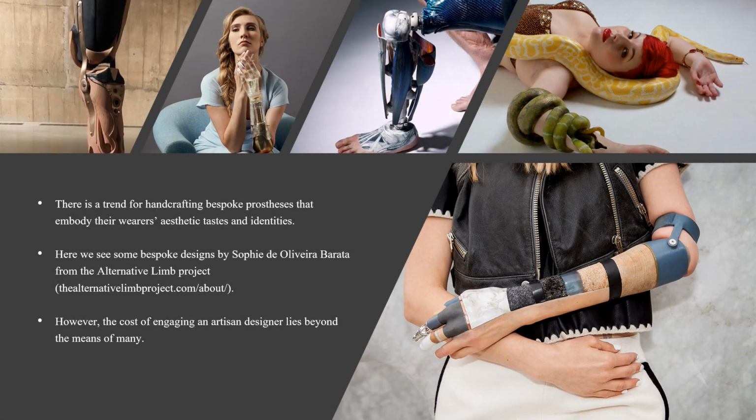There is a trend for handcrafting bespoke prostheses that embody their wearers' aesthetic tastes and identities. Here we see some bespoke designs by Sophie de Oliveira Barata from the Alternative Limb Project. However, the cost of engaging an artisan designer lies beyond the means of many.